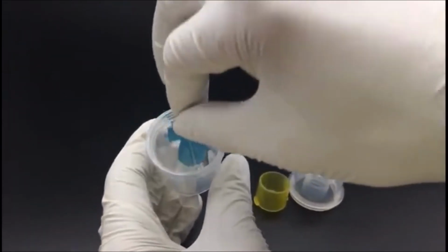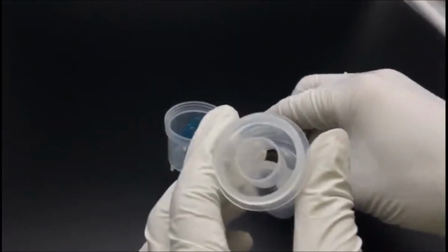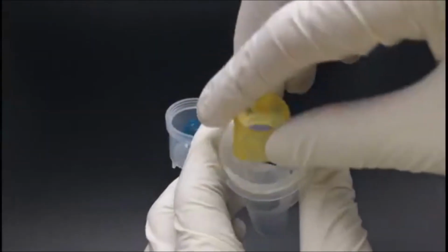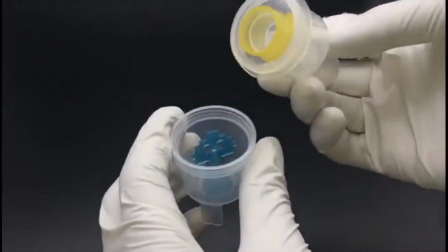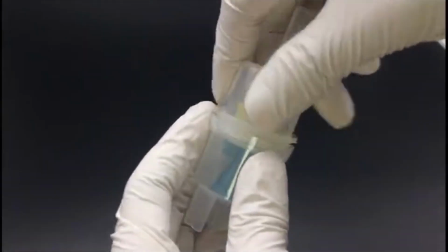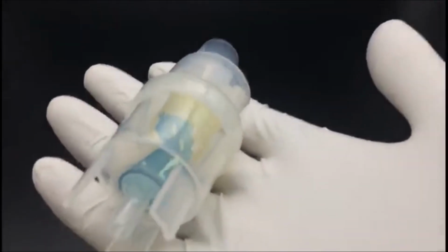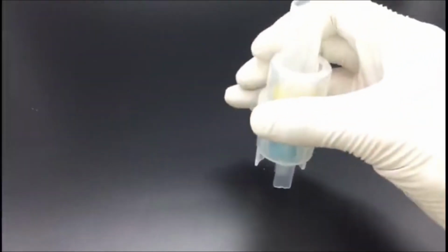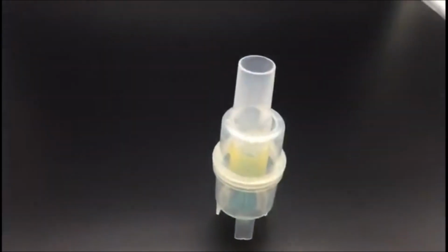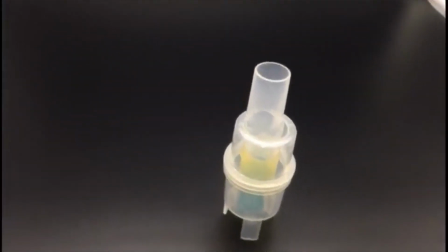A nebulizer is a small machine that transforms liquid medicine into a fine mist. Breathing in this mist carries the medication to your lungs. Unlike an inhaler, you don't need to learn a specific breathing technique. You simply breathe normally into the mouthpiece or mask. Nebulizers are typically used to help treat respiratory conditions, such as asthma and COPD. They can be easier to use than inhalers, particularly for young children and people with severe lung conditions or arthritis. Always use and clean your nebulizer by following instructions provided by your healthcare provider and the machine manufacturer.